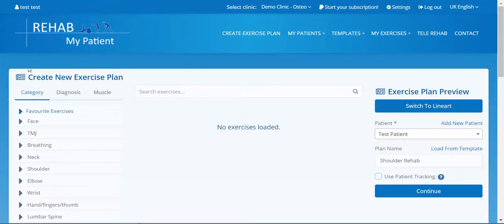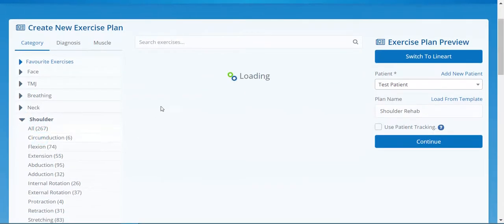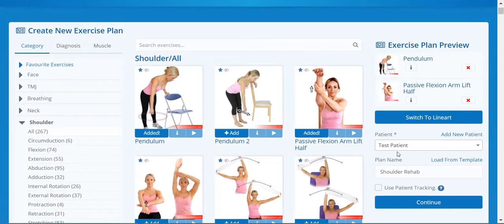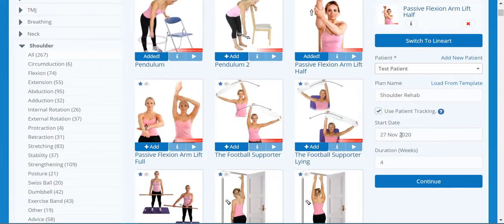You asked for it, we provided it. We've included patient tracking that includes patient reported outcome measures. To get started, create your exercise program — let's create a shoulder plan and add shoulder exercises. Simply click the patient tracking option, choose your start date, which is probably going to be today, and set the duration of how long the program is going to run.